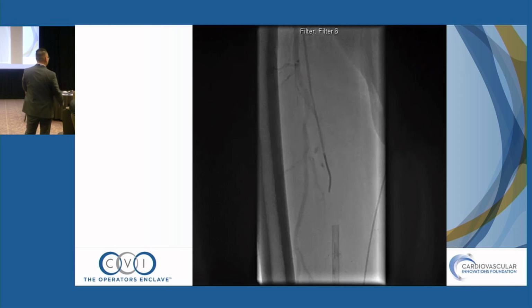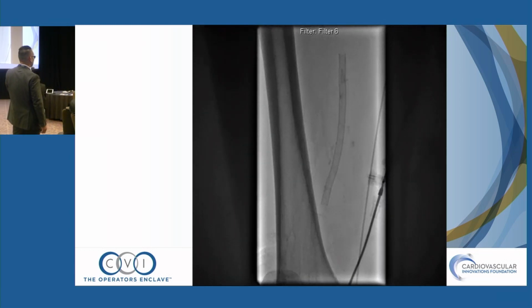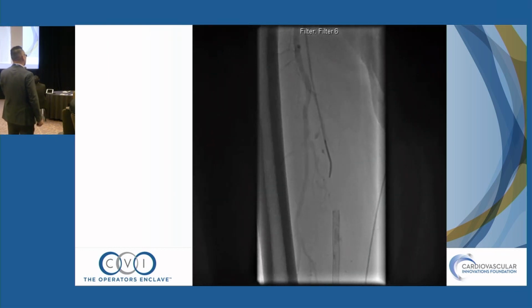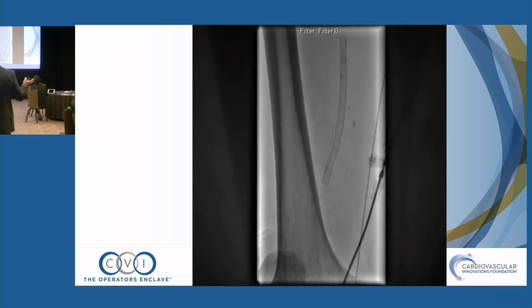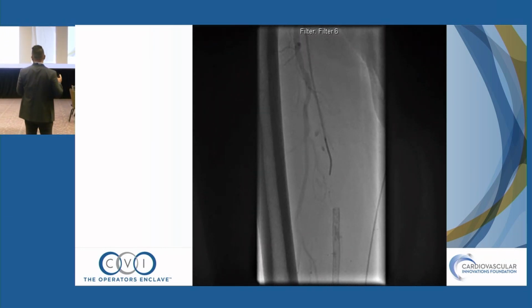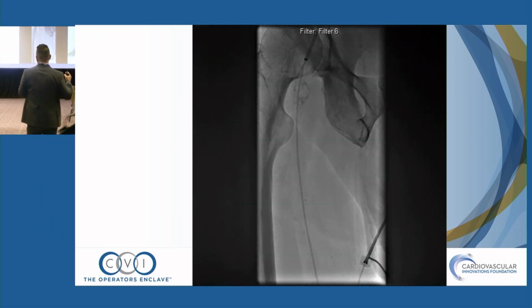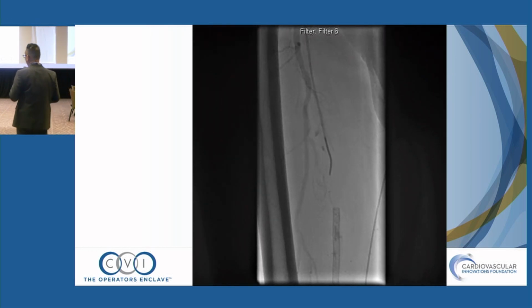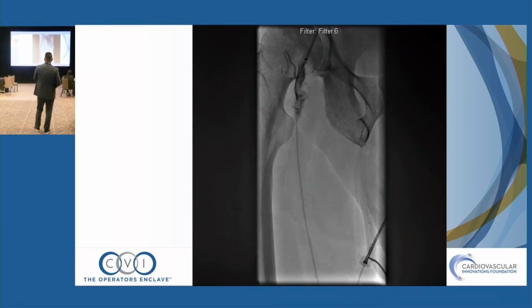The orthogonal view, good? Right. So I think that's what I was getting at. So take maybe at least two, maybe even three orthogonal views, because sometimes you'll see a nipple or something in another view. Sometimes you can look at the other side, because it's mostly symmetrical. Also, external ultrasound, just like when you got access, you can really see a Navicross catheter really well. I use vertebral catheters because they're cheaper, but you can point right at it and really try to push on it. And so that's what we did.